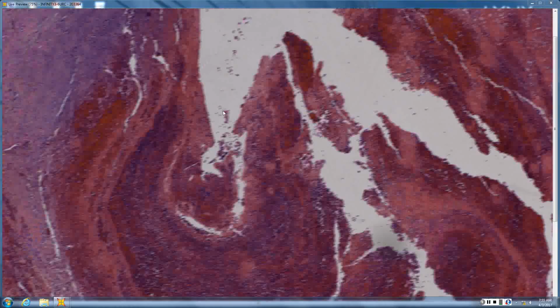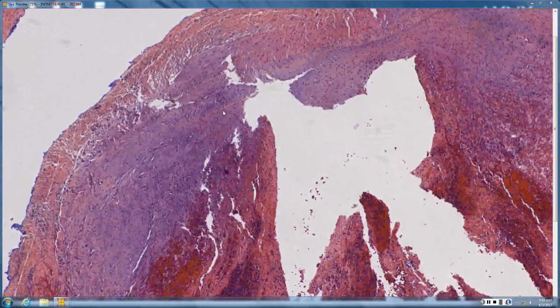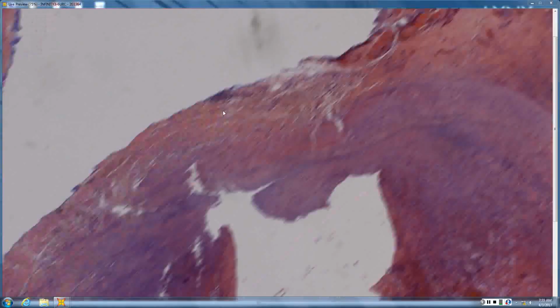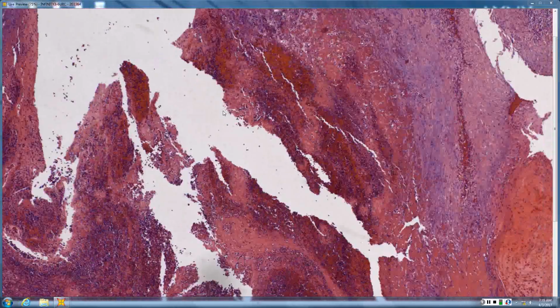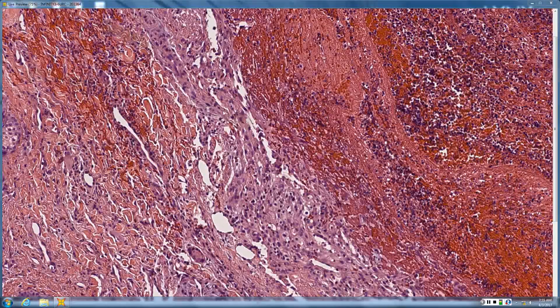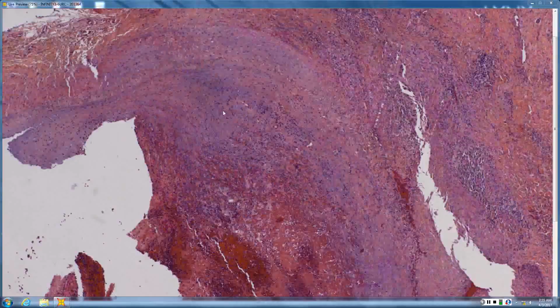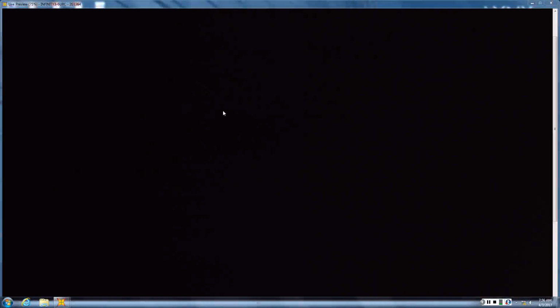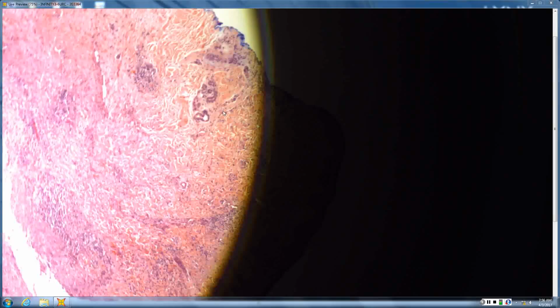So it looks like basically just a large phlebolith, and there's maybe some recanalization somewhere. I'd be favoring IPH. I haven't really seen the area yet. The whole thing's a little confusing, right? There's a big clot there, and then towards the periphery of the clot you do have some crack-like spaces that look almost like angiosarcoma, but they're clearly at the edges of a big clotted vessel. And you know it's a vessel partly because you can see a big internal elastic here, right? See that big wavy internal elastic membrane? So you are correct that this is a variant of intravascular papillary endothelial hyperplasia.